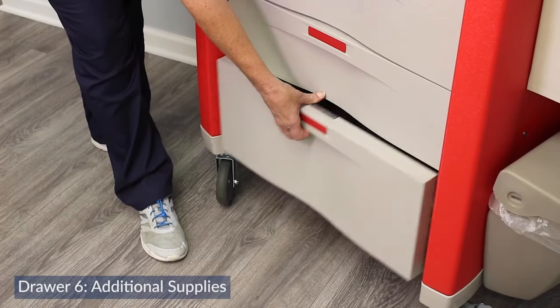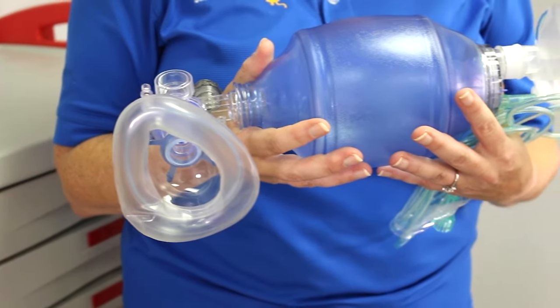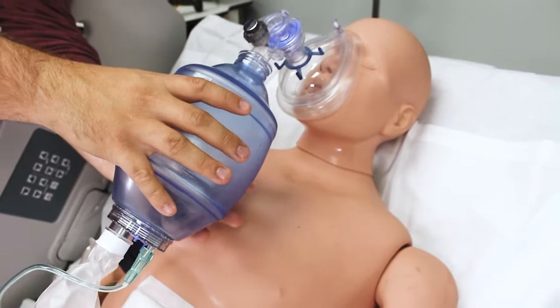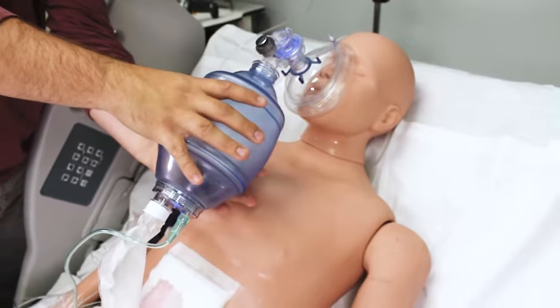The sixth drawer contains a variety of emergency supplies including a resuscitation bag for adults and children. We've also got gloves, suction tubing, and oxygen tubing.